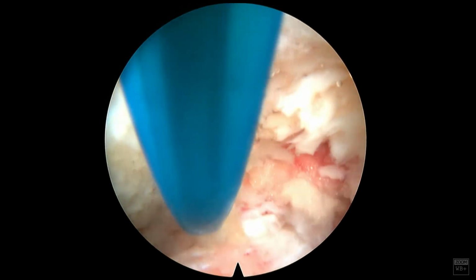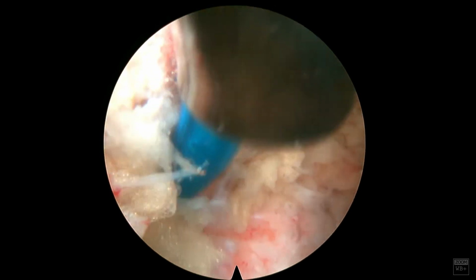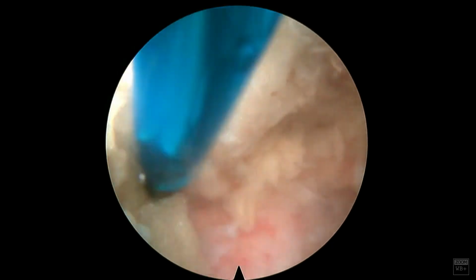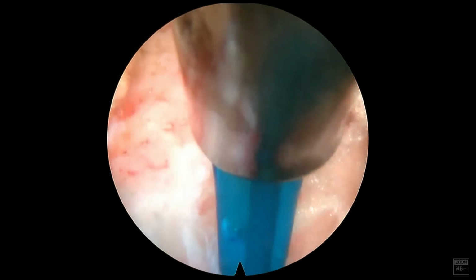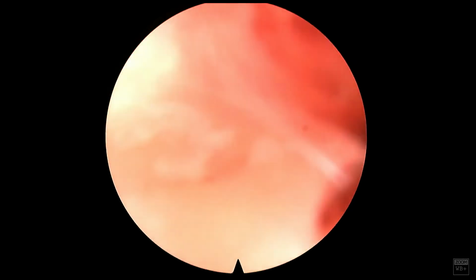Again, traditionally you should see the traversing nerve in the canal. This patient did not have lateral recess stenosis symptoms. So again, I'm really trying to clean up the foraminal window, rather than the lateral recess. Sometimes using your trajectory is good and bad. If your trajectory is too high, if you come in too cranial to caudal, then you won't ever be able to get into the lateral recess.